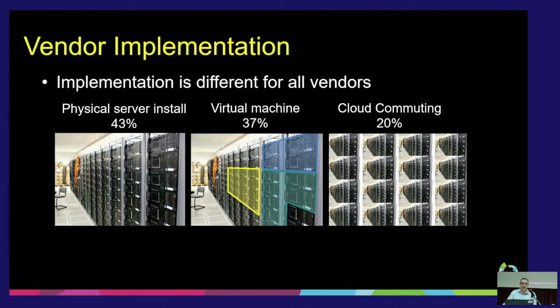And then in other situations, you can do what's called cloud computing, where you actually don't physically have to purchase the server. That server's maintained somewhere off-site. Your software is there, and you never have to worry about it. They will maintain the hardware. Everything is taken care of. You would just log in through the web, and you would be able to do all your work on that dose monitoring software virtually.